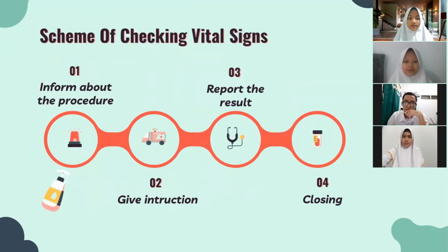To make it easier to carry out the procedure, we use a sequence of checking vital signs. Firstly, inform about the procedure. Secondly, give instruction. And thirdly, report the result. And the final is closing.